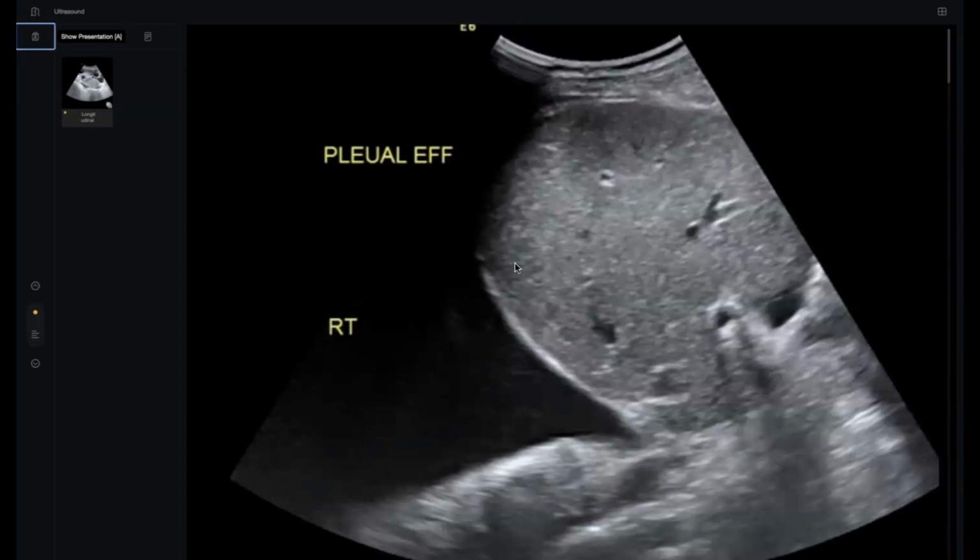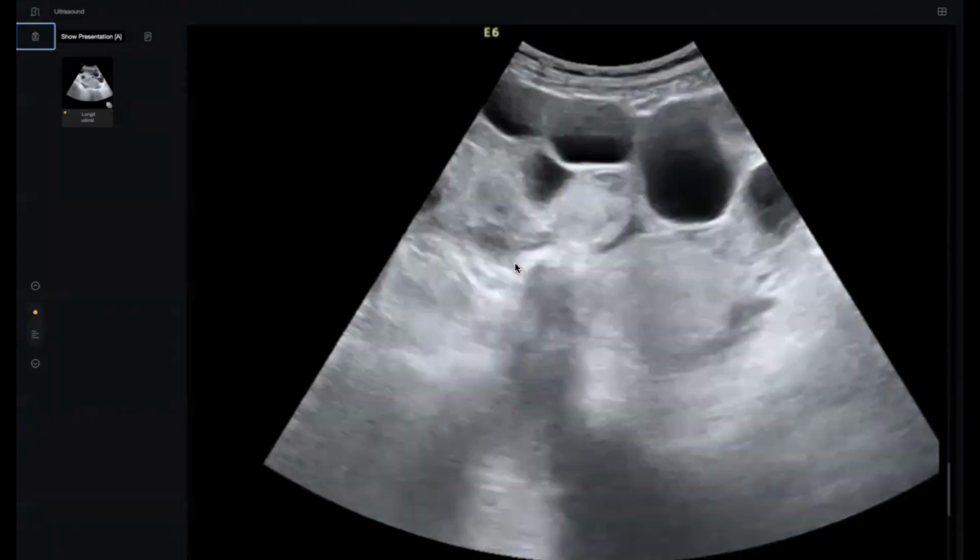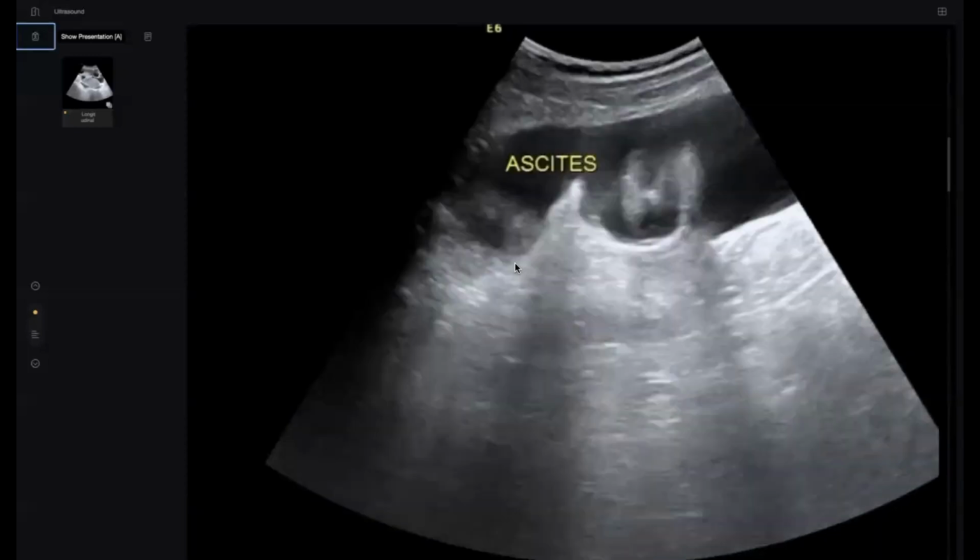Sir, regarding the age of the patient, a young 30-year-old, with multiple bilateral enlarged ovaries with effusion, I suspect she may have taken treatment, like hyperstimulation, because in this age group most patients have this treatment. Excellent. This is a hyperstimulation syndrome. Thank you so much, doctor. You did very well. Markedly enlarged bilateral ovaries associated with ascites and pleural effusion.